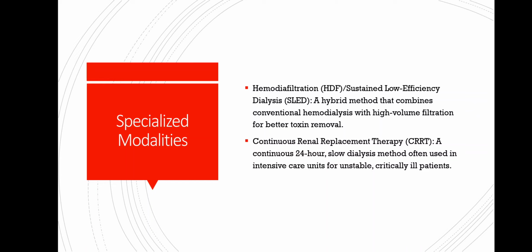It's continuous renal replacement therapy, a continuous 24-hour slow dialysis method often used in the intensive care unit for unstable or critically ill patients.